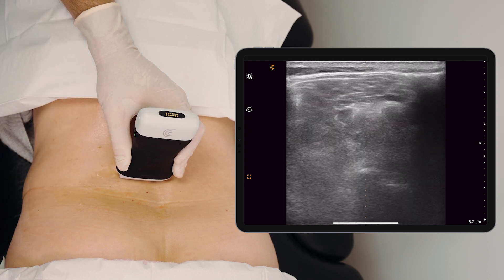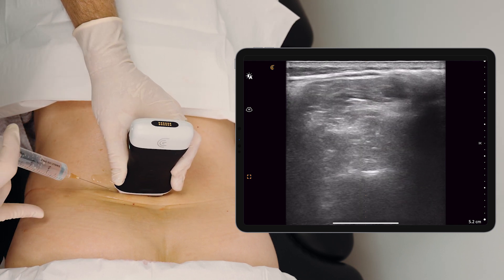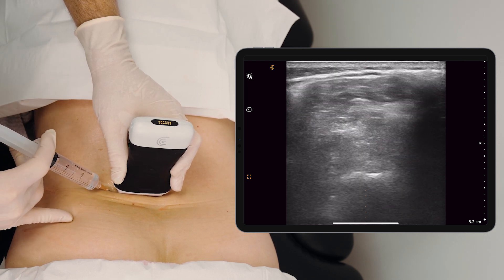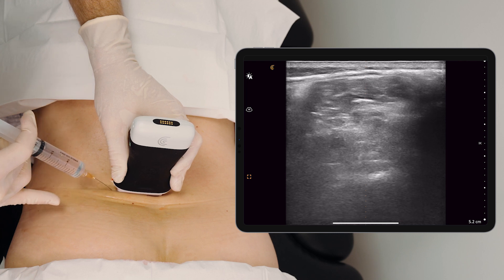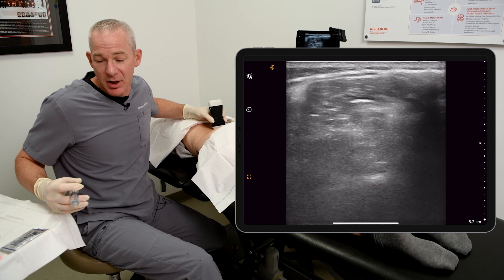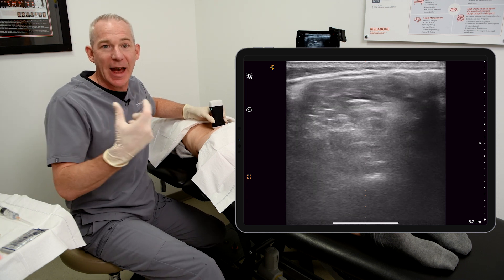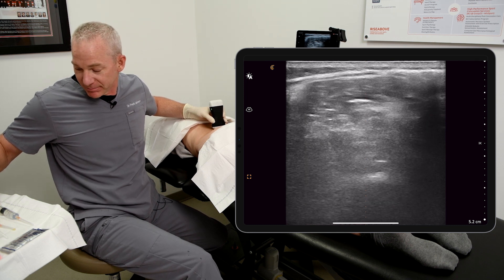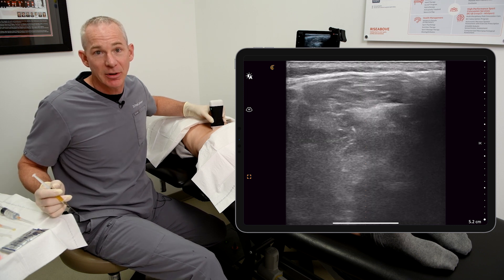I'll now travel down to the next level, inferiorly. This is going to be the L5-S1 facet joint. Now, can I see my needle perfectly all the time? No, I can't. But with practice, I can tell where the needle is traveling by adding a small amount of injectate and watching what happens with the tissues around it. So now, having frozen up the L4-5 facet joint capsule and the L5-S1 facet joint capsule, we're now ready to place the PRP.